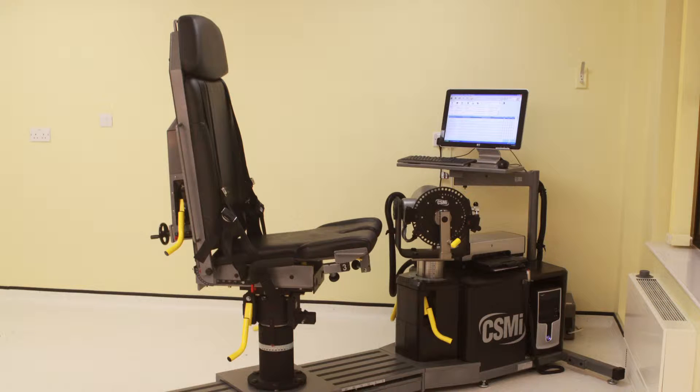The position of the chair is not vital for this test, as long as it does not impede the motion. The chair can be used to hold on to for stabilization if required. In these circumstances adjust the chair to allow the subject to hold it.